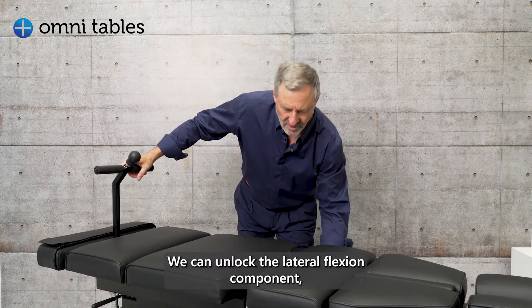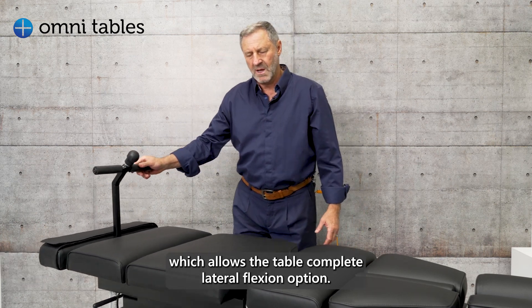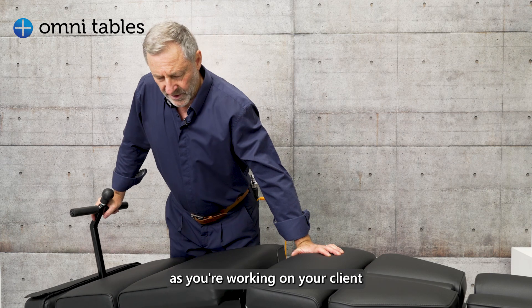We can unlock the lateral flexion component, which allows the table the complete lateral flexion option, and from there you then create an elliptical movement to separate as you're working on your client.